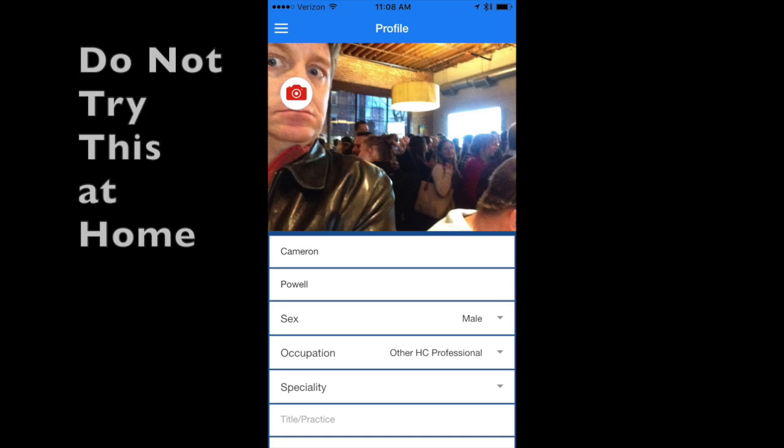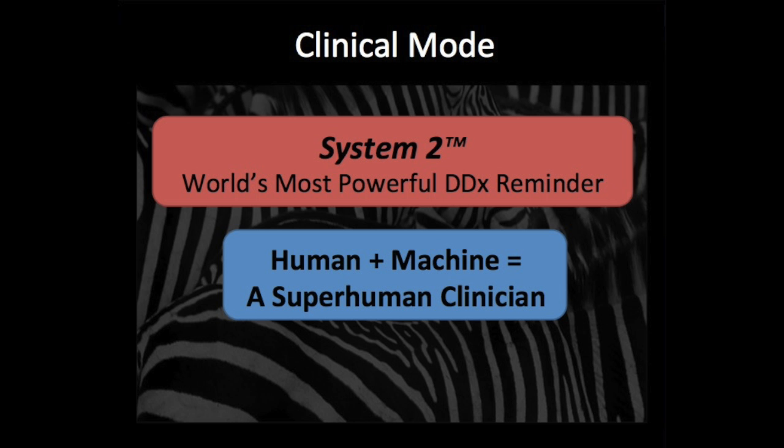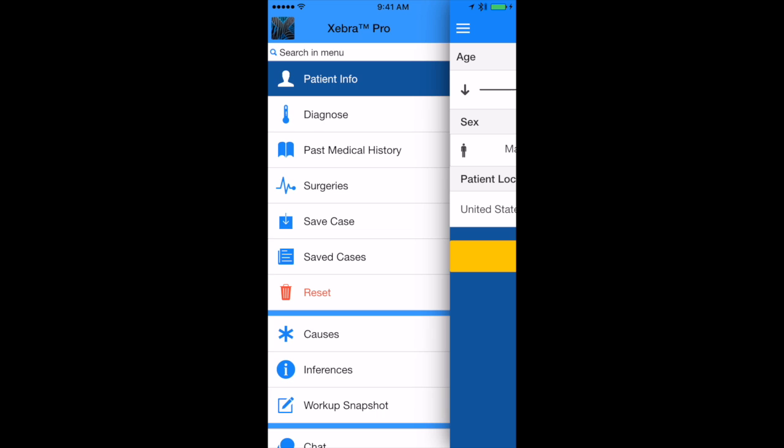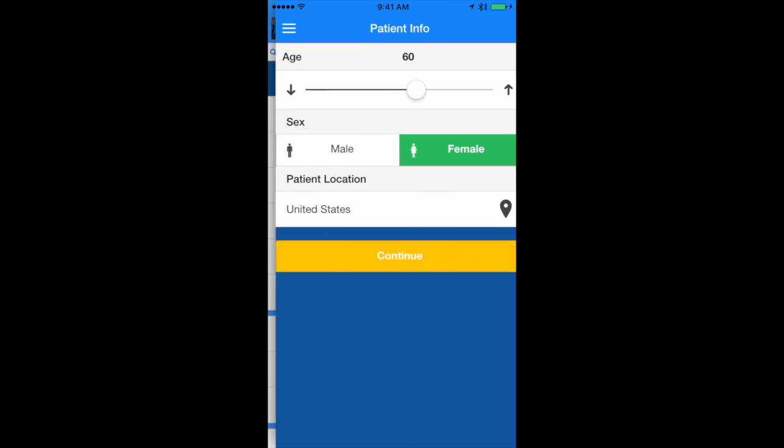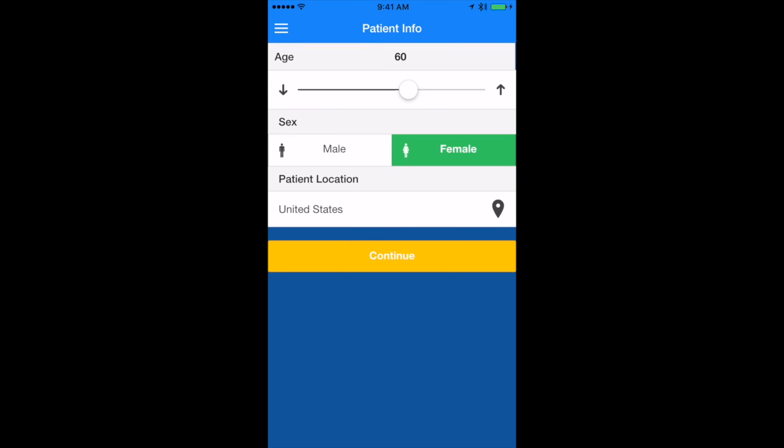My account leads to your profile. Here's how to use clinical mode's unmatched differential diagnosis. To begin any diagnosis, tap patient info and then enter the demographic information.